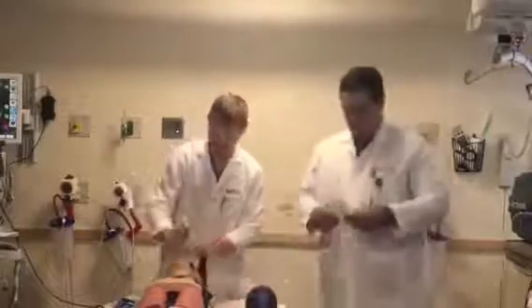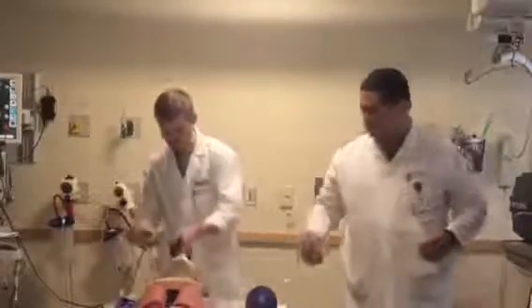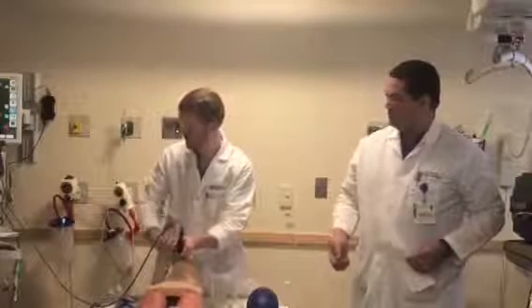Okay, and then we'll put it in. I really advocate doing it also with the laryngoscope. Yeah, like you have a laryngoscope and try with the laryngoscope to put it in the larynx, but if you couldn't put it, that's fine.